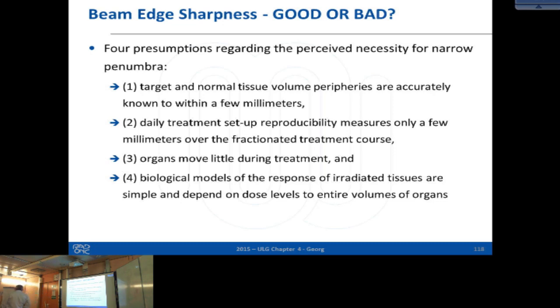But the point is the following: in many of these radiation protection authorities, in radiation oncology we are somehow in a different position because our patients have cancer, and then this extra dose is somehow not so much considered. On the other hand, we are also in a difficult position because we do imaging during therapy, and there are all these factors for how you can convert your exposure to millisieverts and so on, but those are all radiation protection factors. And if we perform, let's say, 40 times a cone beam CT, we get extraordinary numbers.